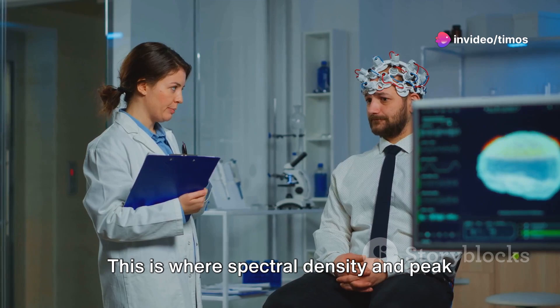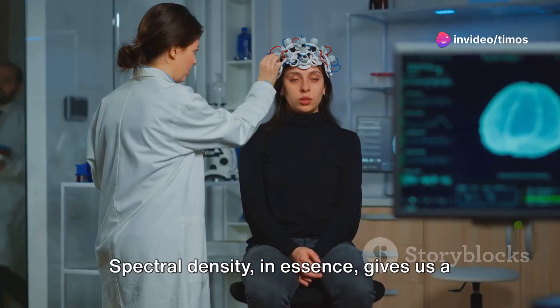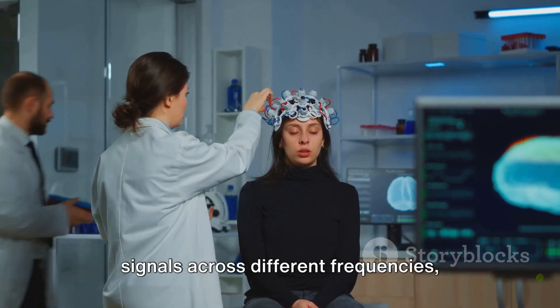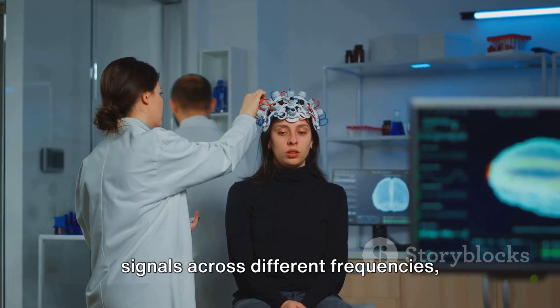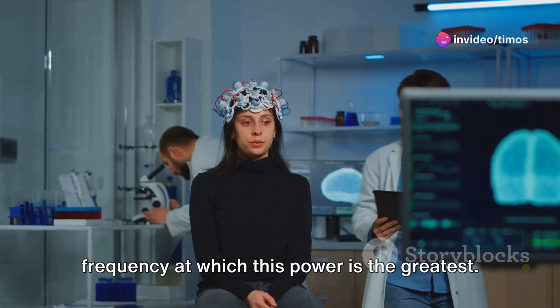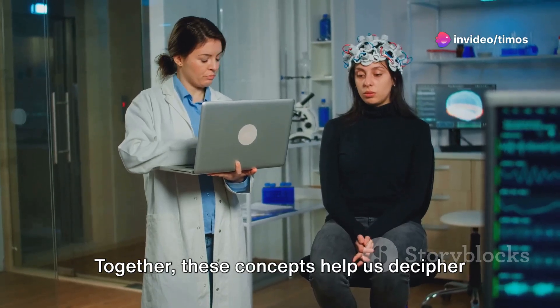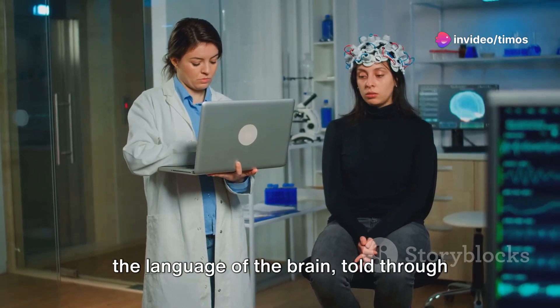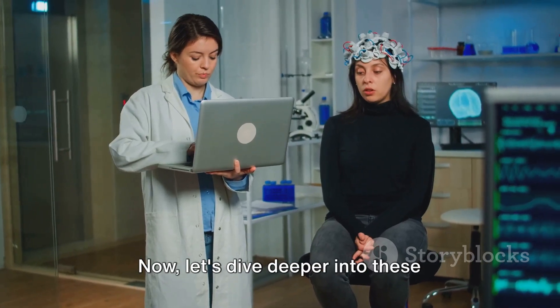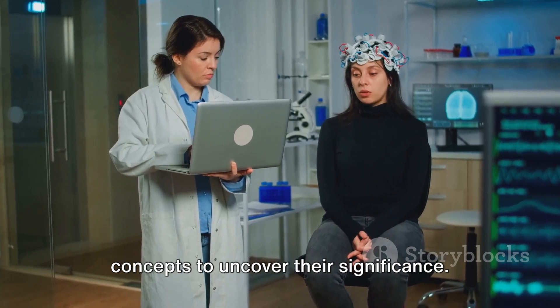This is where spectral density and peak frequency come into play. Spectral density, in essence, gives us a way to understand the power of these signals across different frequencies, while peak frequency pinpoints the frequency at which this power is the greatest. Together, these concepts help us decipher the language of the brain, told through the medium of EEG signals. Now let's dive deeper into these concepts to uncover their significance.